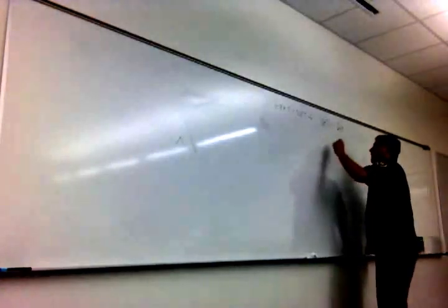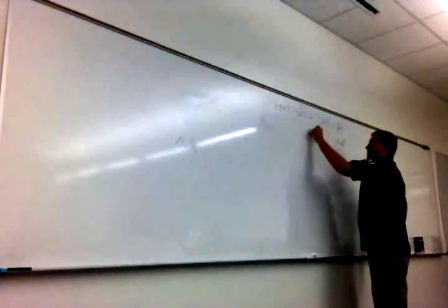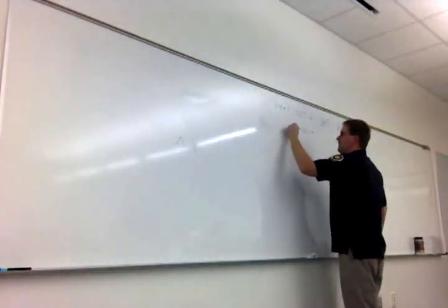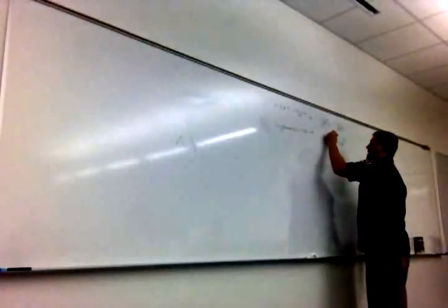And then I have my PaO2, which is my measurement of oxygen. It doesn't really tell me anything about my acid-base balance, though. I don't look at my oxygen to figure out my acid-base balance. And what's a normal PaO2? Normal range is 80 to 100 millimeters of mercury. It's a pressure. And 90 is perfectly normal.